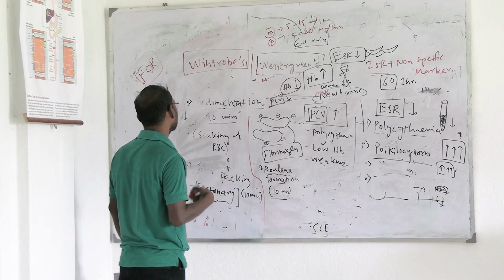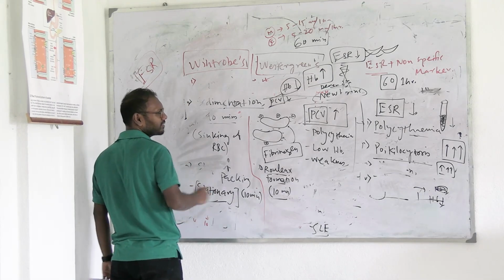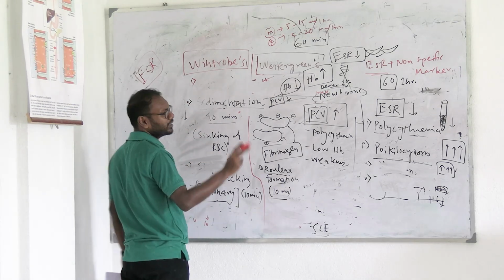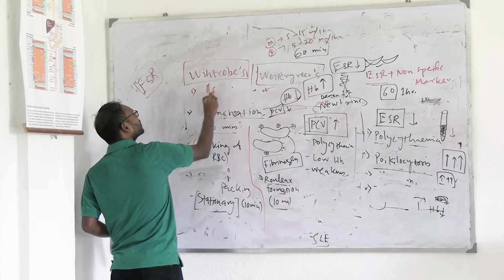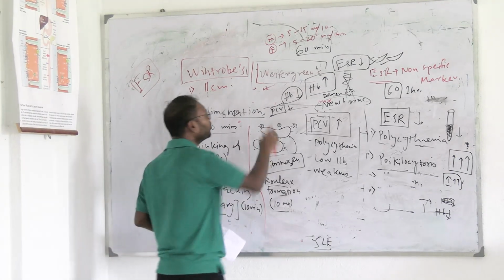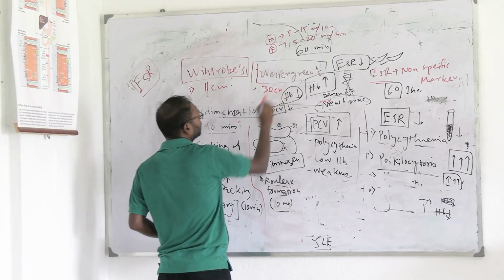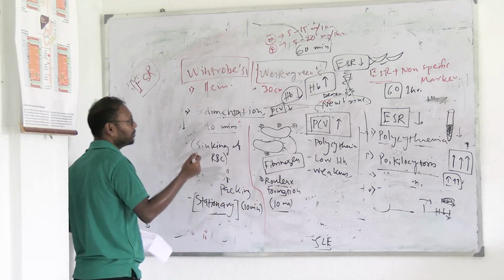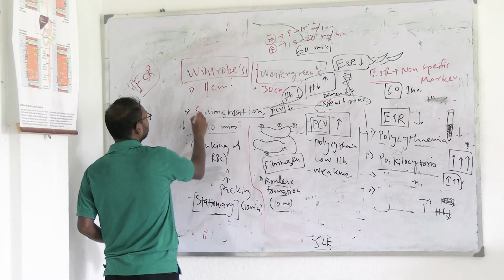So what are those? First is the length. The Wintrobe's tubes are small, their length is 11 cm. Now the Westergren's tubes are actually 30 cm long. The difference in height is definitely visible, so you will be able to recognize it. Now second is sedimentation.